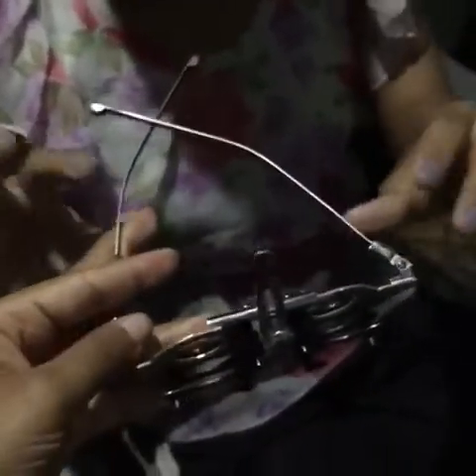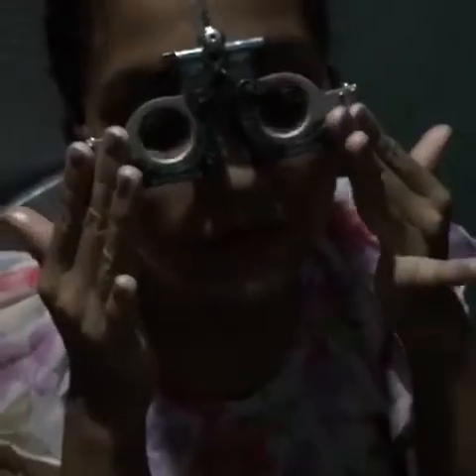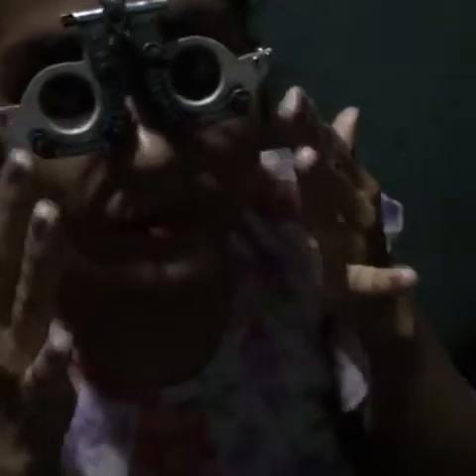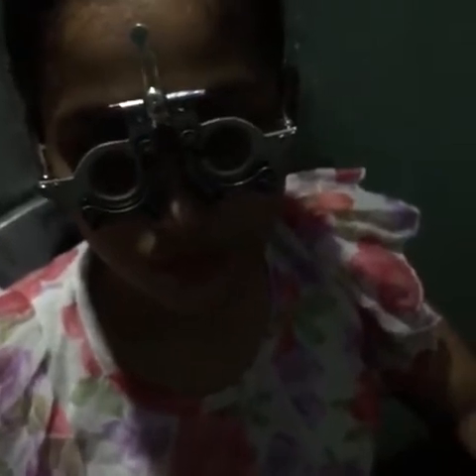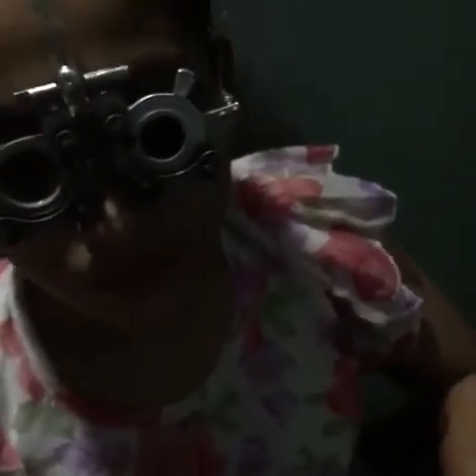Now we will ask the patient to put on the trial frame. Please put the trial frame. This is a monocular test, so we have to perform it monocularly first and then we have to perform it binocularly. So we will occlude one eye. Let's first test for the right eye.